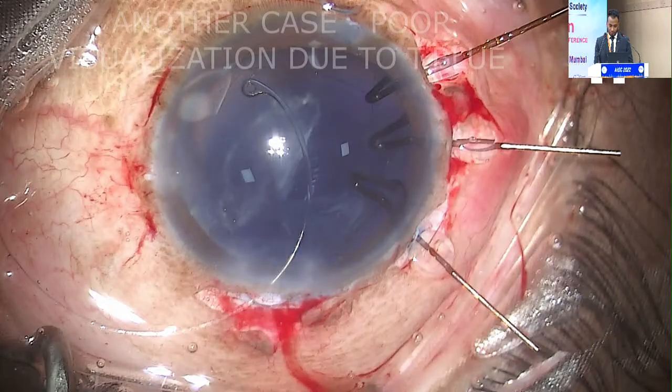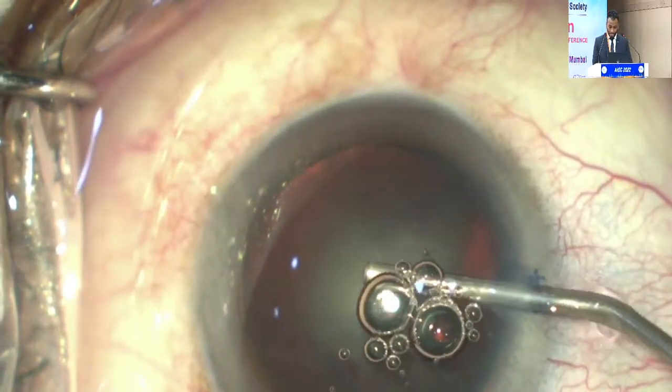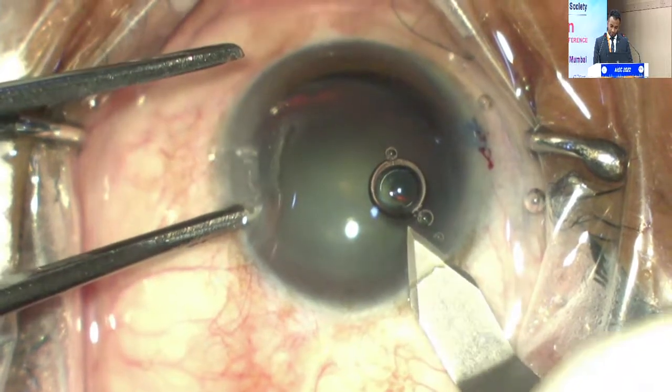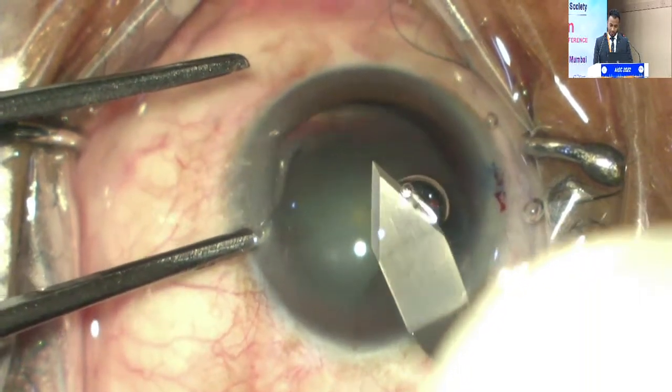And see, this is what happened. This was the most recent case I've done. I put a trypan blue, I was waiting for a trocar injection, and it has trickled back, and I could not see anything when the retro-illumination is not there. So it's a very important step to not let your trypan blue go behind. Your visualization aids in your surgery. A clear phaco incision of 2.8 was done.